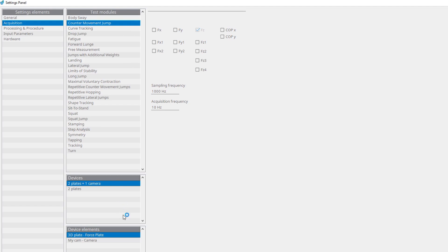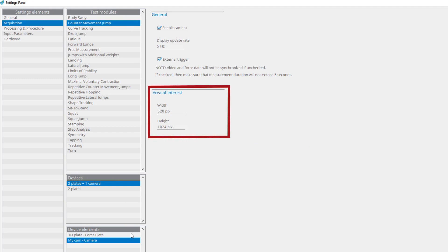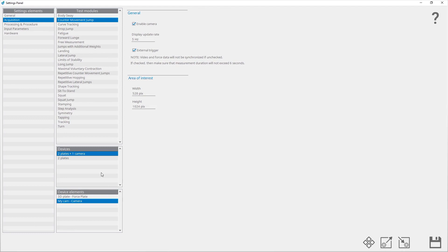Under the acquisition panel, you can also set the video properties for each test module separately. You can enable or disable video capturing, set the display update rate, and use the external trigger to synchronize video and force data. Video and force data won't be synchronized if this option is unchecked. You can also set the width and height of the video area of interest.